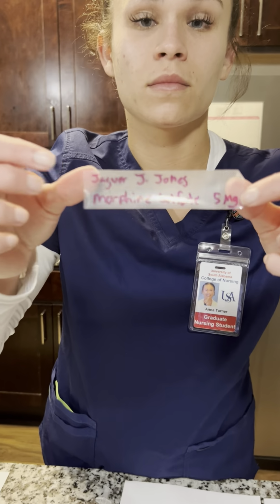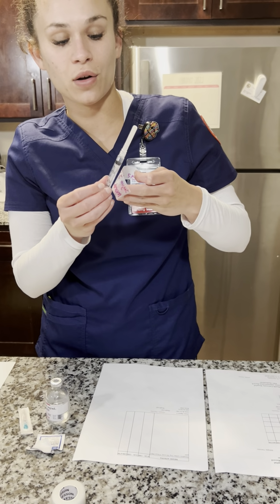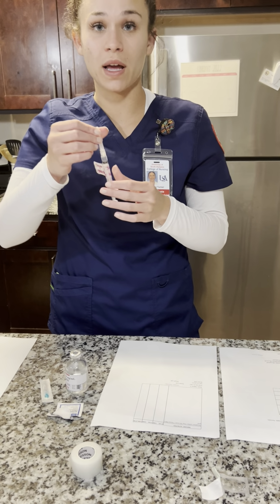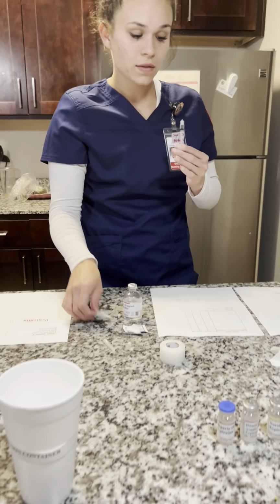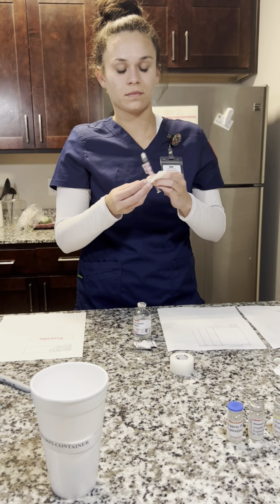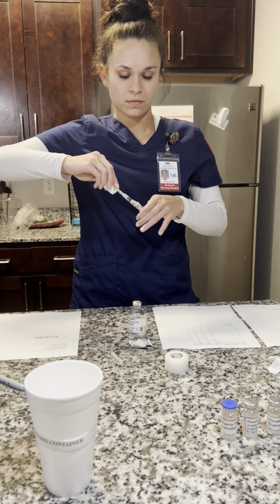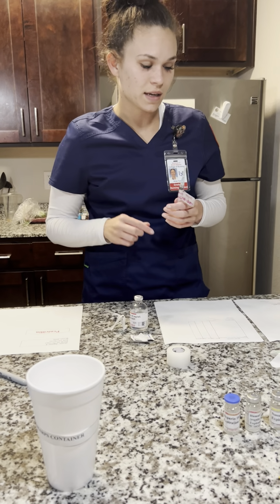Okay. And I'm going to place this onto the middle of the syringe without covering up where you can see how much medicine is in it. And at this point, I'm going to take off the blunt tip and place the needle on there, without touching it. And I'm also going to place the blunt tip cannula into the sharps container.